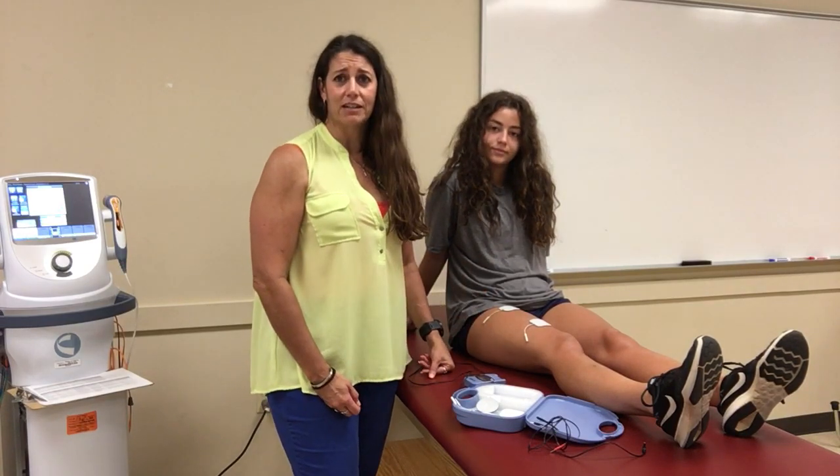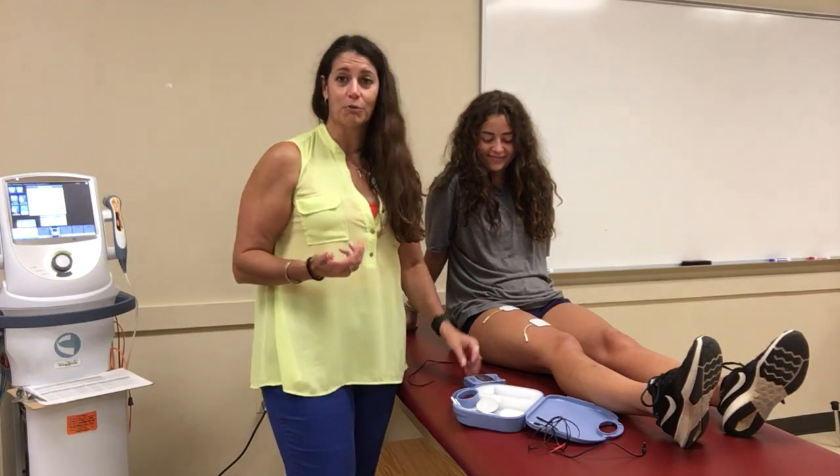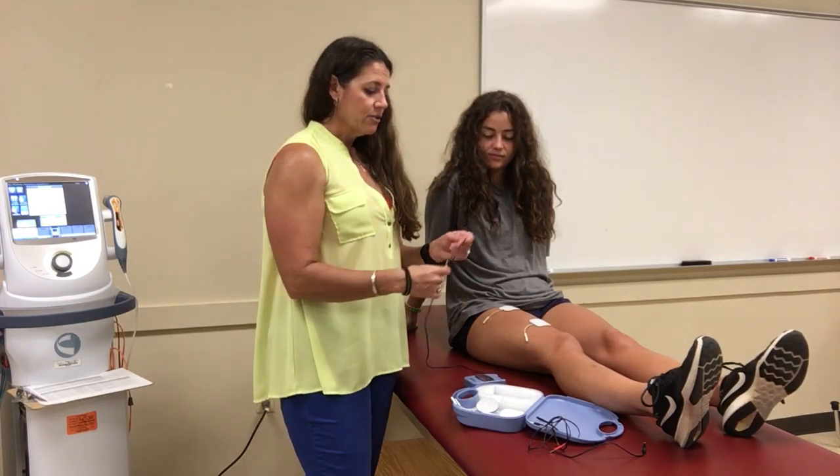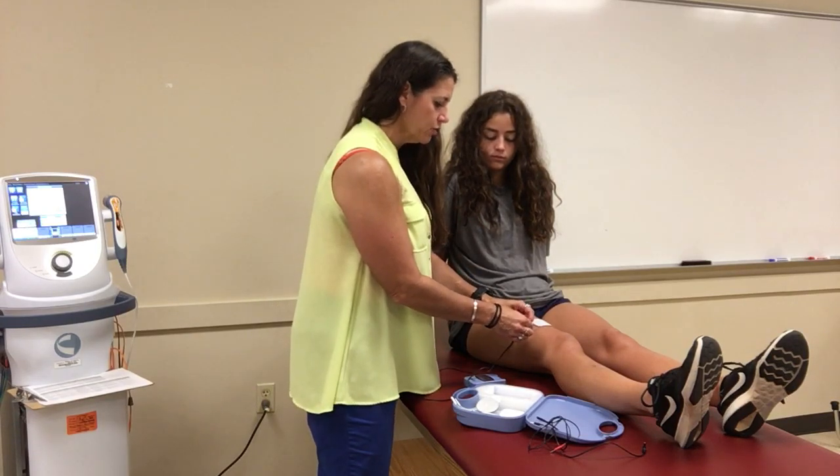I use these a lot on the bus because you don't have a big stim machine with you, so they work really nicely. They have two different connectors, so you just plug them straight in.